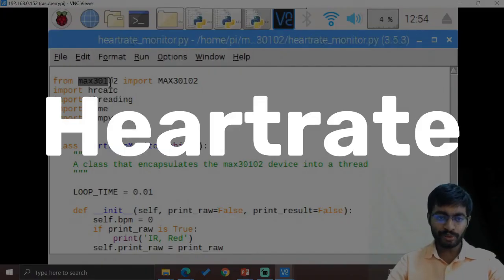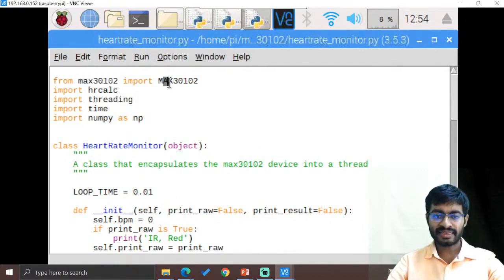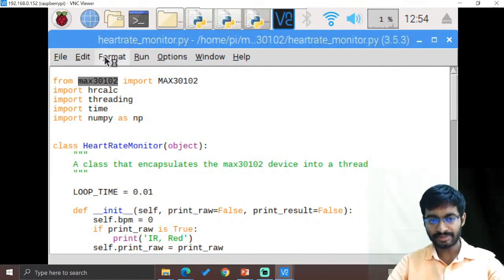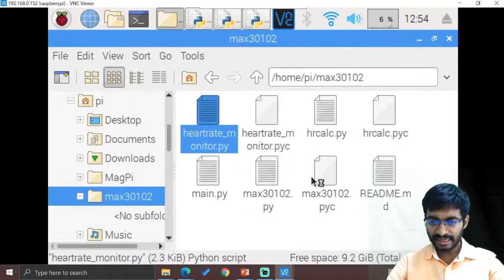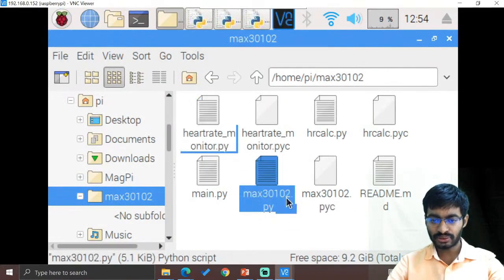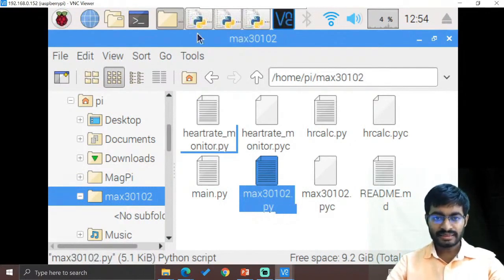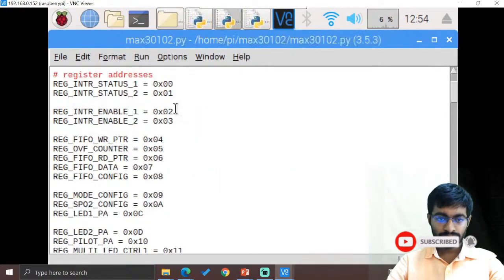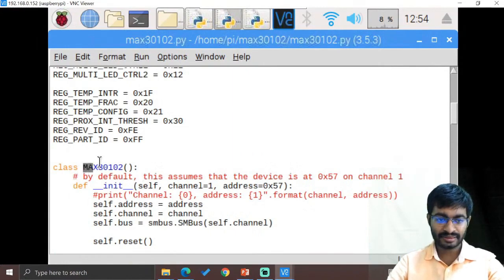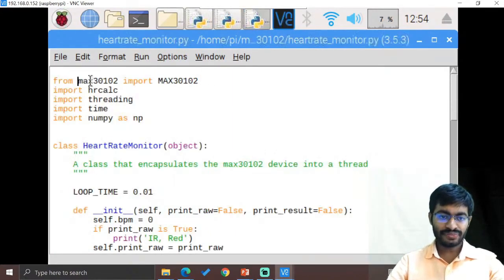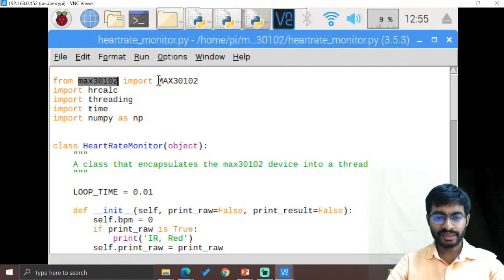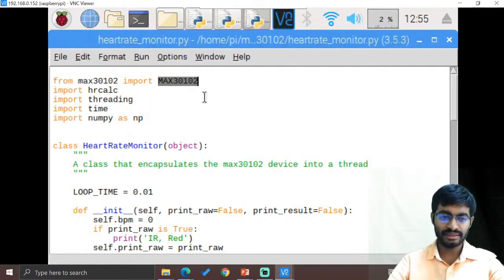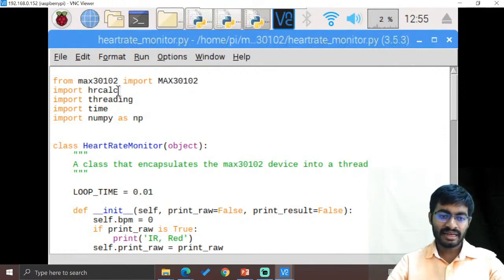Here we have imported MAX30102 — that is the common file name. How to import our own libraries: the file name is max30102.py, and the class is defined as 'MAX30102' (in caps). The first step is to import the file name, and from that file name we import the class. Similarly, we have another class known as heart rate calculation — HR calculation means heart rate.